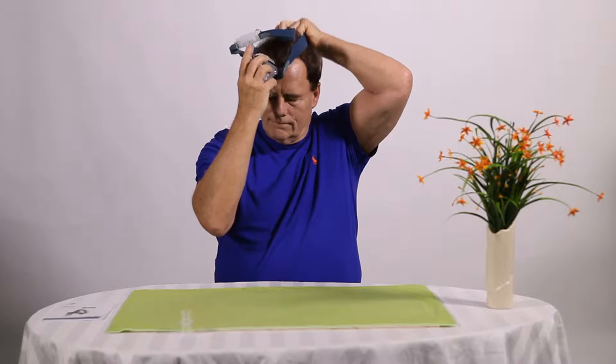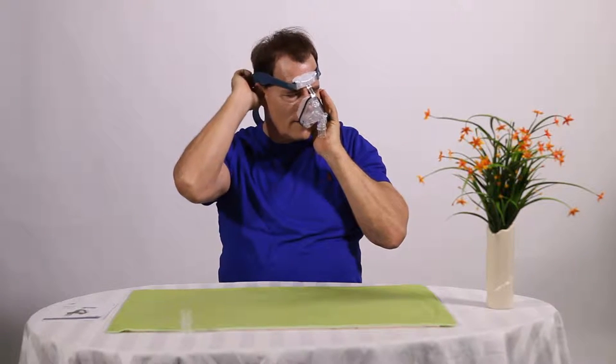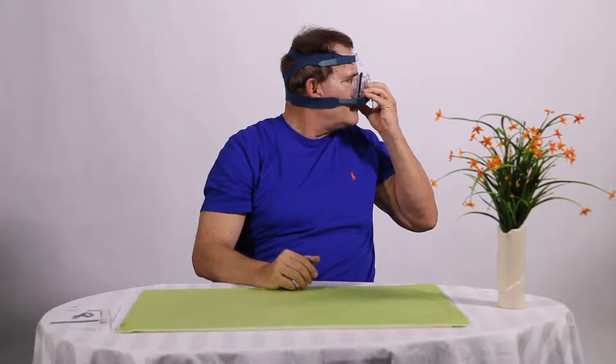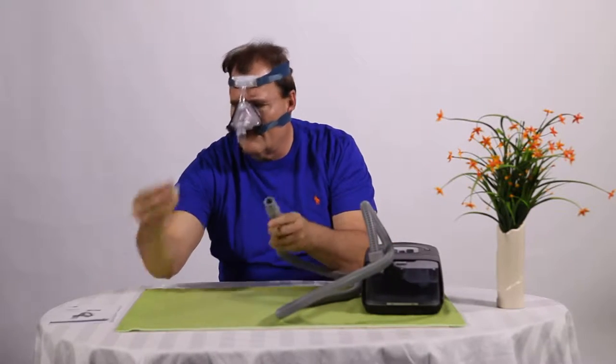Place the mask cushion over the patient's nose. Pull the headgear over your head. Gently tighten the headgear straps to the proper length to avoid leak. Connect the tube in the mask to the elbow.